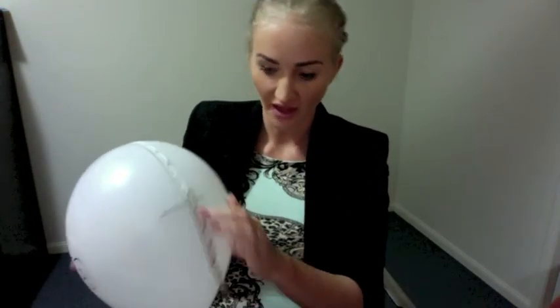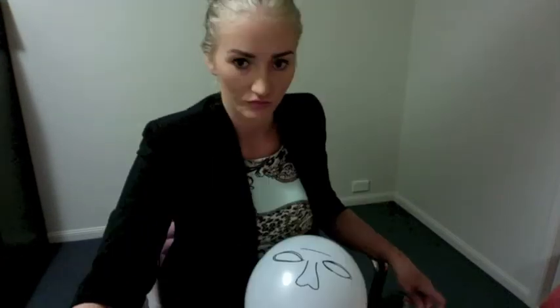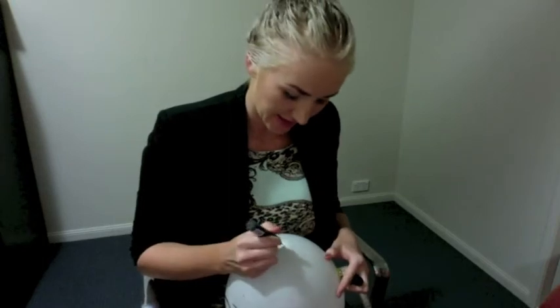To determine the sagittal plane, we need to measure from the nasion to the inion, like so. And we'll take that measure as 30 centimetres. So what we do is we will place a mark at 15 centimetres, half of 30. That will now be our CZ mark.